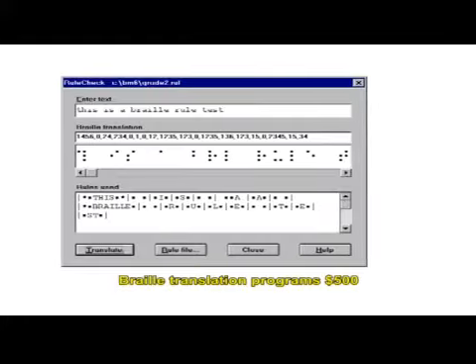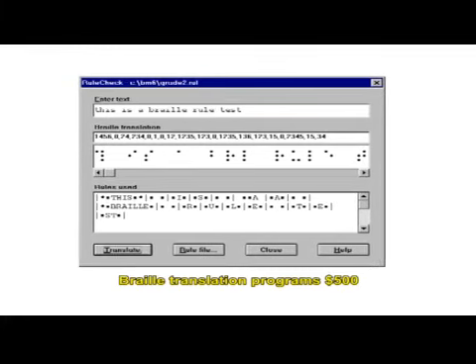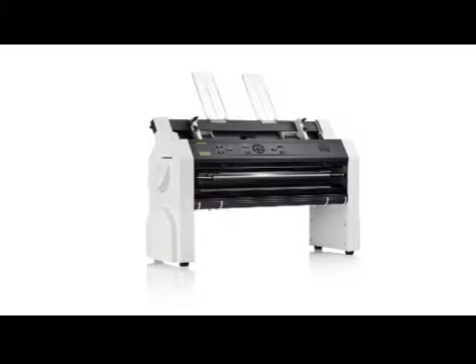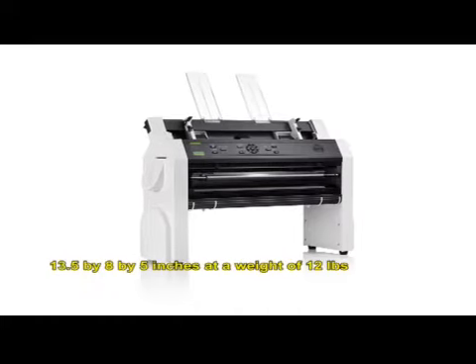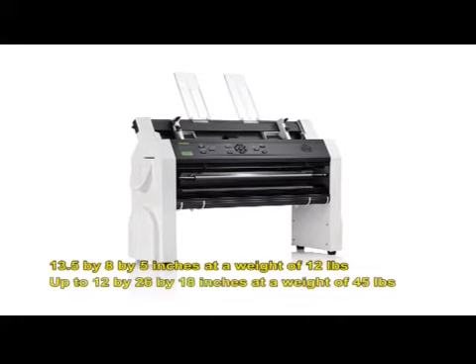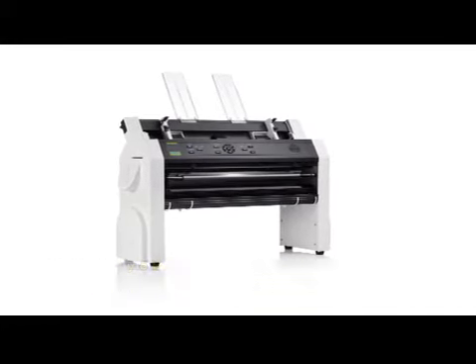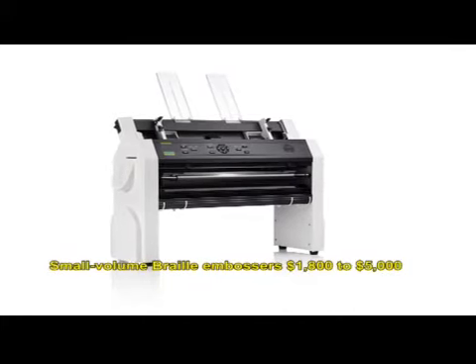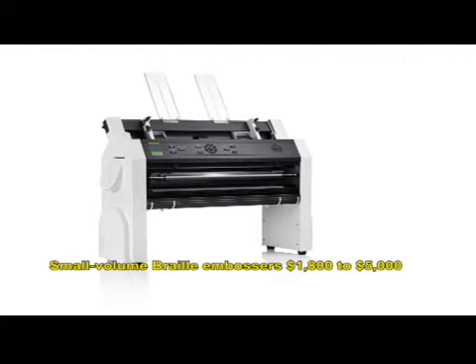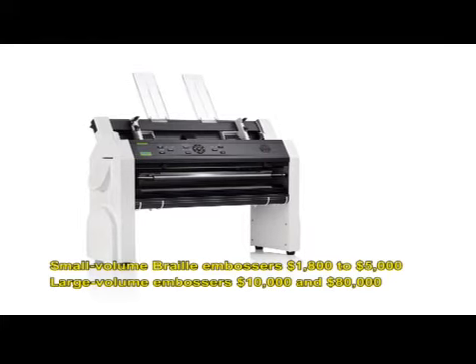There are several Braille translation programs available, and the most widely used programs cost approximately $500. There are numerous embossers on the market, and they range in size from 13.5 by 8 by 5 inches at a weight of 12 lbs up to 12 by 26 by 18 inches at a weight of 45 lbs. Small volume Braille embossers range in price from $1,800 to $5,000, while large volume embossers cost between $10,000 to $80,000.